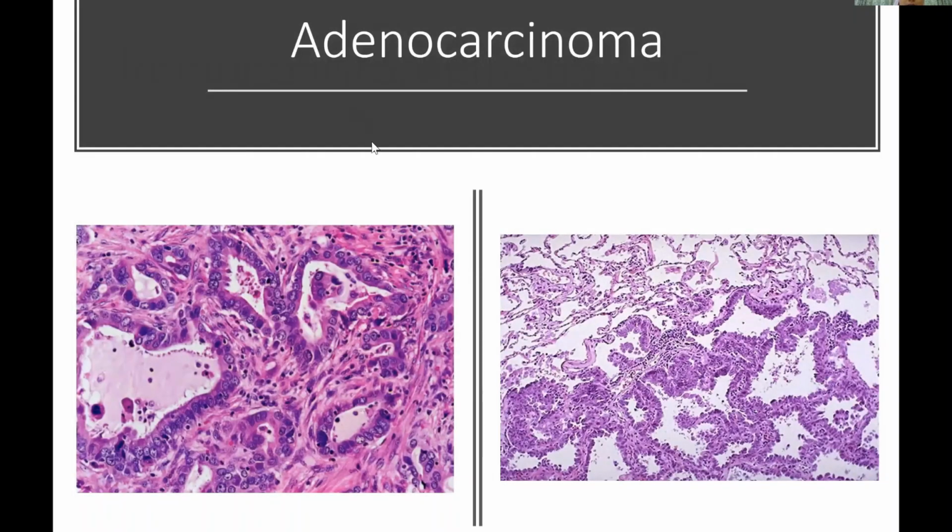These are sections from the lung, because you can see a normal alveolar tissue here. Here there is infiltration by malignant cells. You can see the malignant cells forming glandular structures, with lumen spaces inside lined by the malignant cells. On higher magnification, again the malignant cells form glandular structures, and the individual tumor cells all show anaplastic features and morphology.